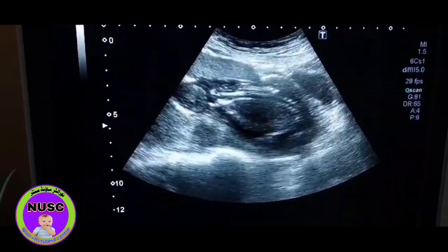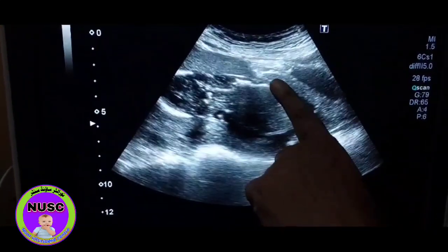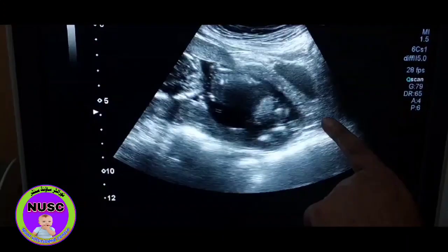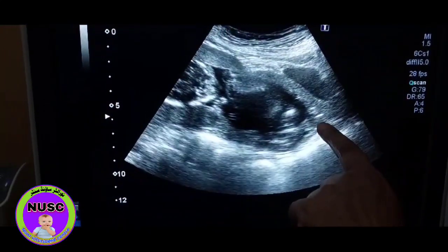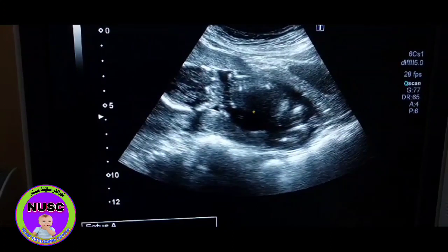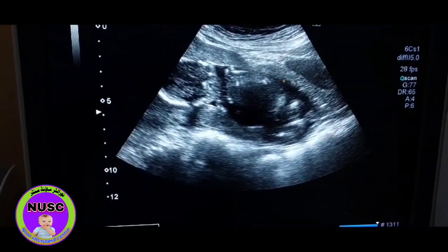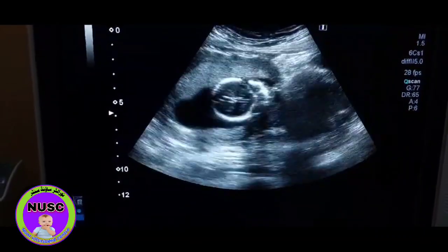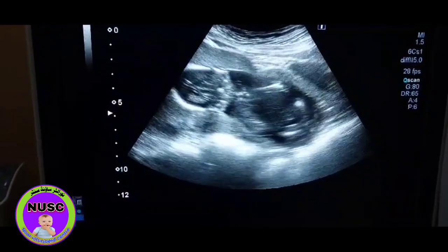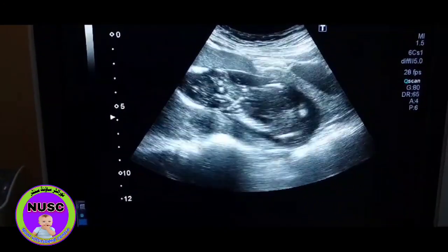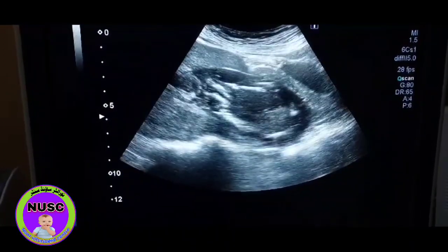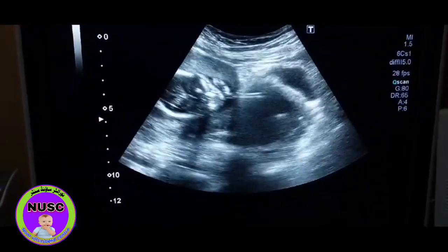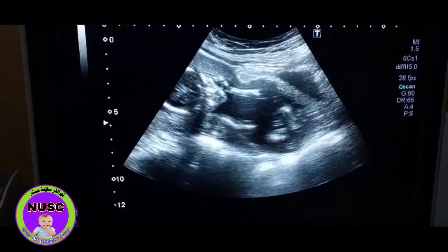As you see here, this is the anterior cervical wall and this is the posterior cervical wall. This is the external os. It is a fully dilated cervix, measuring 4.5 centimeters in diameter. The fetus is totally present — the head is present in the uterine cavity, and the body of the fetus is present in the uterine cervical canal.